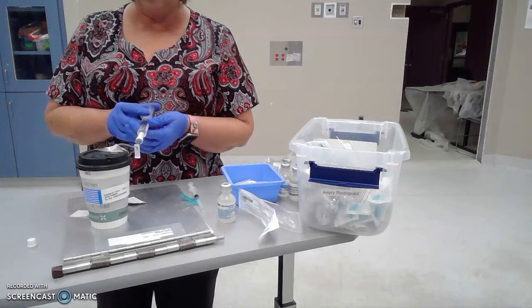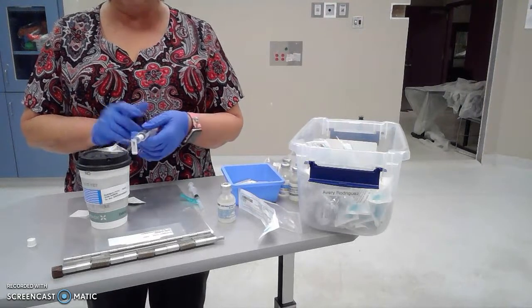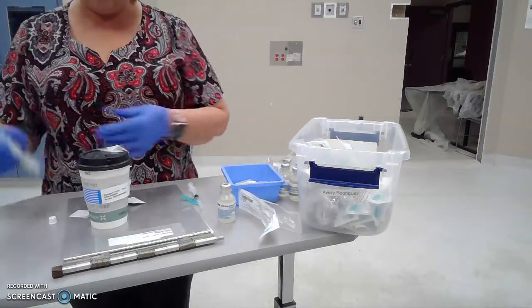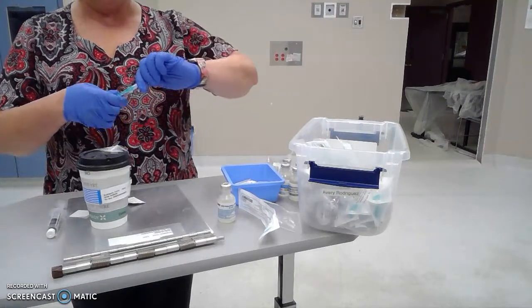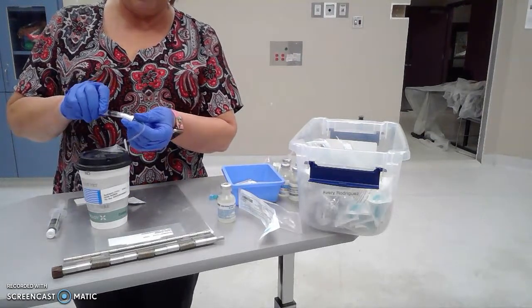While I'm pushing this 5 milliliters, I'm looking to see if there's any swelling, if there's any pain, if there's any leakage or anything going on with the IV site. I don't see anything, so I've got my 5 milliliter flush in. I've got my medication now. I take off the needle, clean the site, attach my medication.